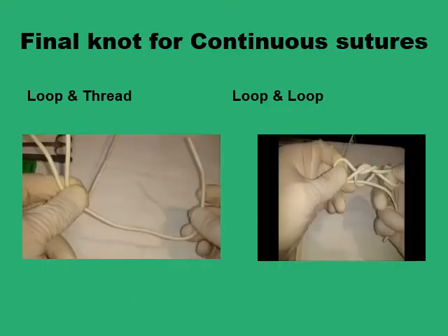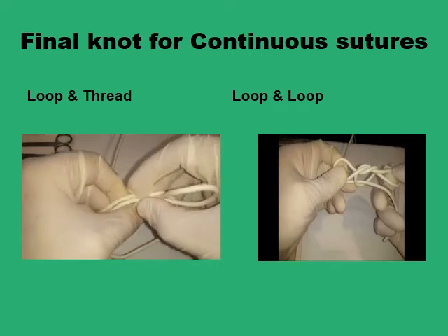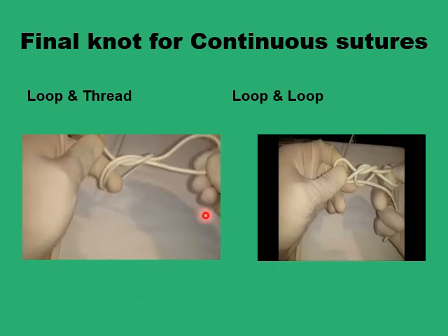The problem of forming the final knot for a continuous suture pattern is that you will be left with one single strand of suture to form the knot. Traditionally, the easiest way of sorting this is to loop a part of the single strand to form a loop on one side and use the other free end to form your knot. But that's going to leave you with a fairly unbalanced, unequal knot, as you can see here.